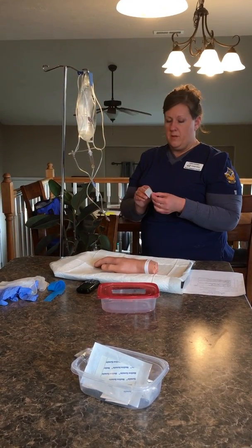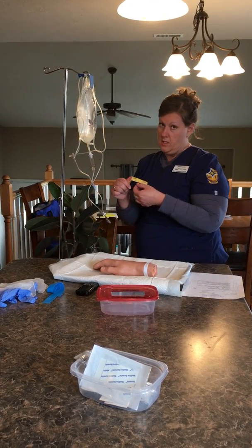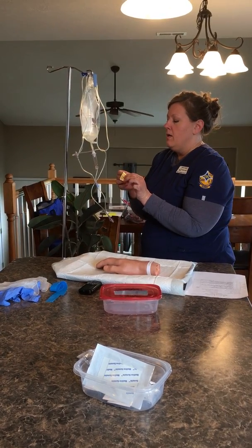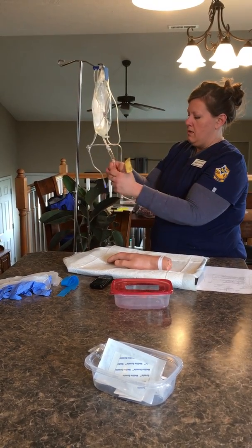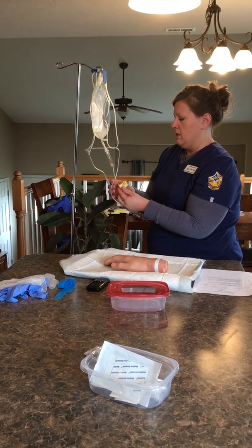Tubing is good for 24 hours, so this will change, even though the sticker says the wrong day. I've written, and you would make sure to use the right sticker, today's date so that they'll know, and then the time of it, and initialed it as well, so that it can be changed at 24 hours.